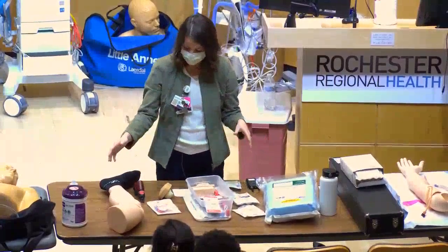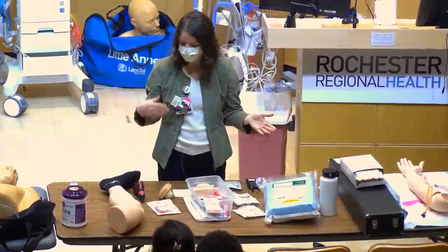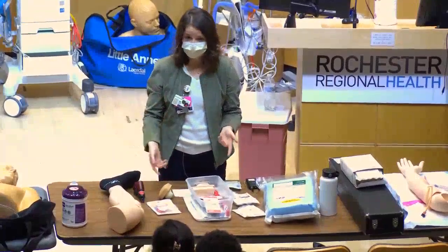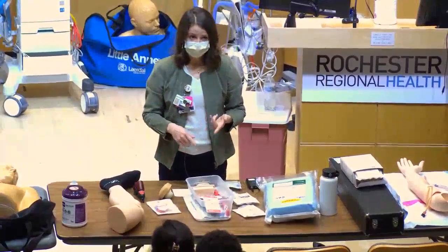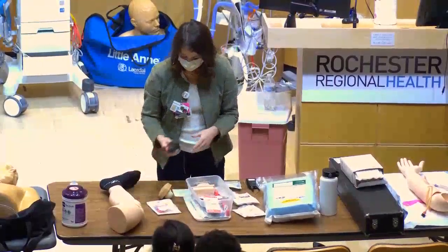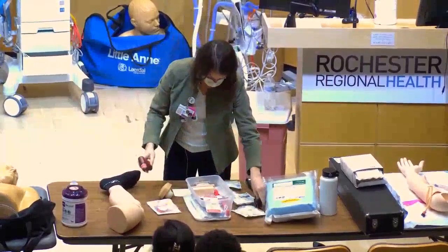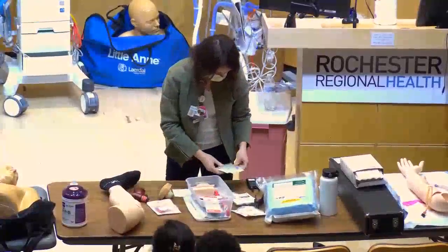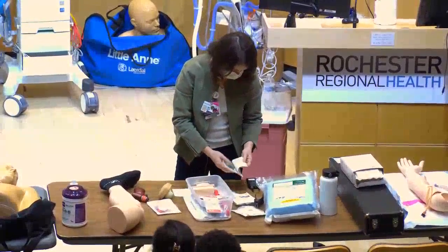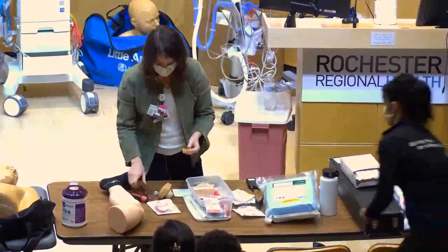Avoid placing an IO at a fracture site, or in an area that has had an IO within the last 48 hours. The needles come in little kits. We'll use the yellow needle so it's easier to see — hook it right up to the drill; it has a magnetic attachment so it won't click all the way in.